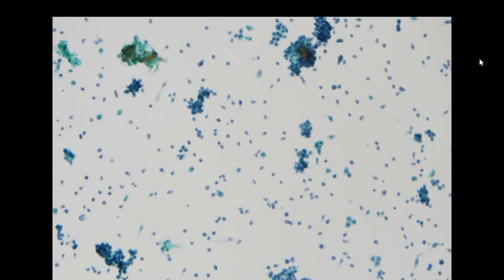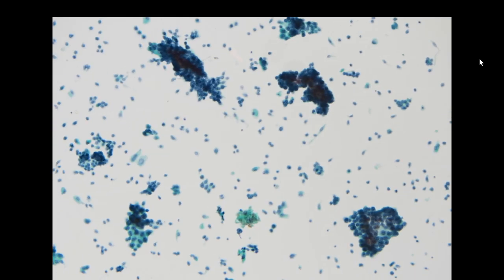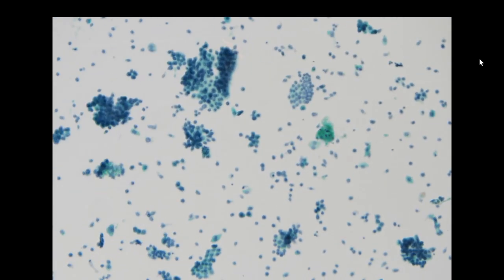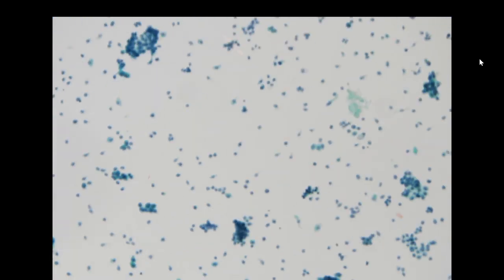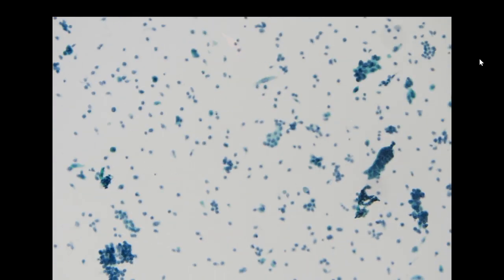So in our reporting scheme, because we don't strictly follow the Paris system, usually we will call these atypical, and we can make a note saying compatible with low-grade urothelial carcinoma or suspicious for low-grade urothelial carcinoma. And because the patient also received a biopsy, I think we will just wait for the biopsy result.